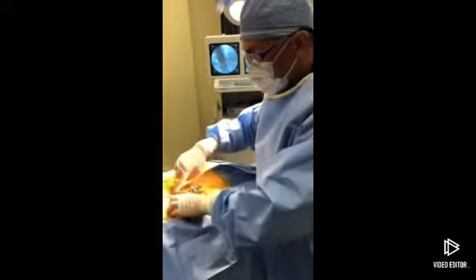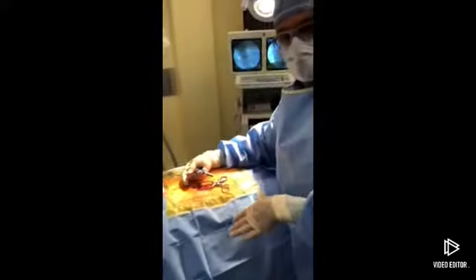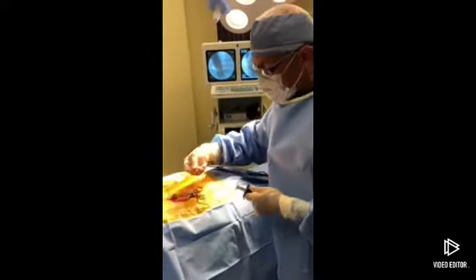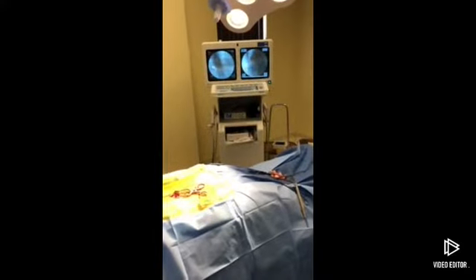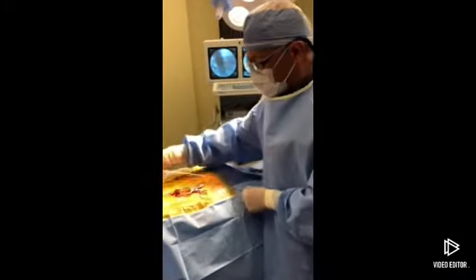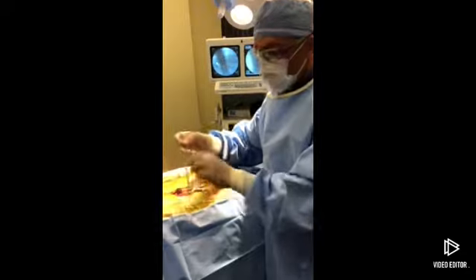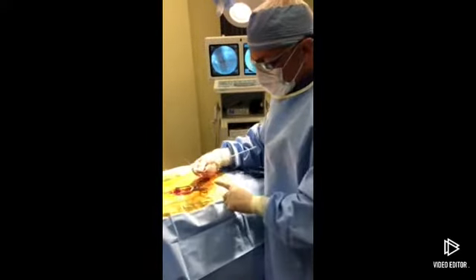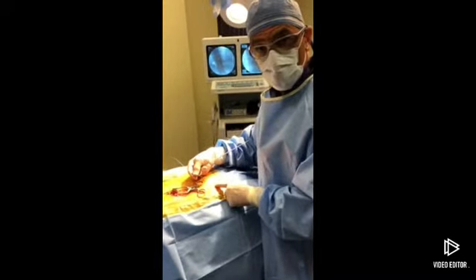And now we have the anchor right over the lead, and now I can just go ahead and take a tie and tie that right down so it won't move. Once that's done, we'll go ahead and take this lead and tunnel it under the skin. This is like a shish kebab skewer essentially, and we'll tunnel from one end to the battery over here. There's a little plastic sheath, and this wire will go through that sheath, and then I can attach this end of the wire to the battery, which we'll show you in just a little bit.